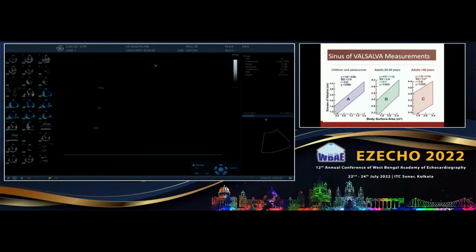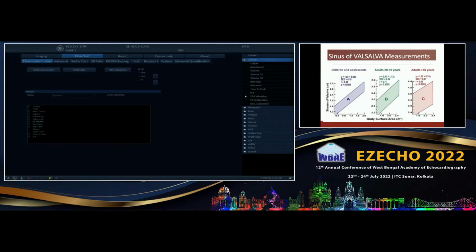On echo, it is very difficult to differentiate. Chandrima, what is the next topic? You can announce from there, no problem. Wait, in the mic. Any case? Yeah, we will go on to the next topic, and we have cardiomyopathy to continue with. Do you have any case on cardiomyopathy? Yeah, we can do the same patient also. Just give me a moment, sir. Any questions?